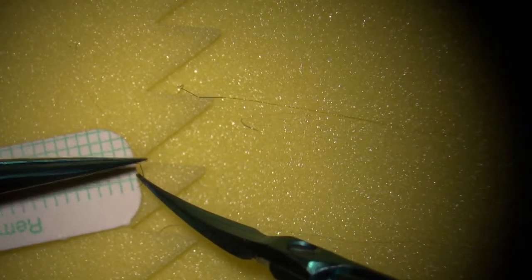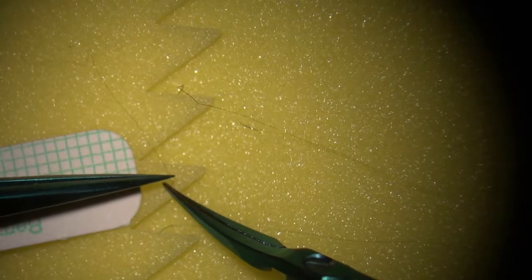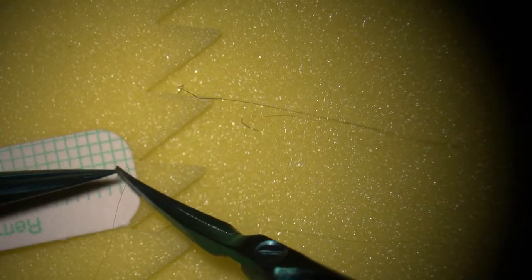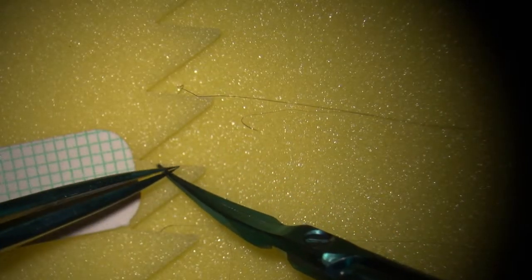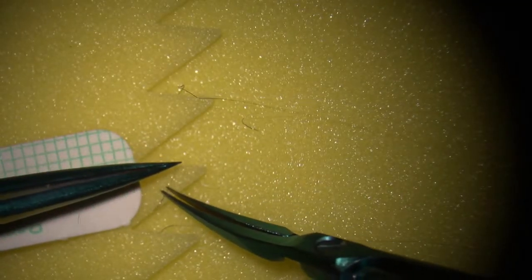So keep low, don't raise it, because the must be out of the, you cannot see through. There we go. Yeah, good. Oh, so you also want to use your background a little bit to support rather than just holding it in midair. Yeah, use the background or the surface to stabilize the instruments. That makes it a little bit easier then.